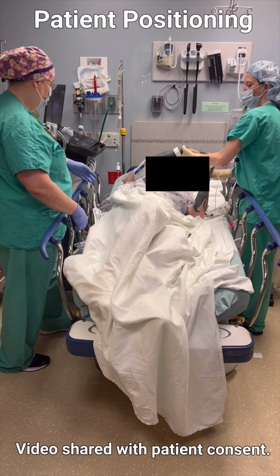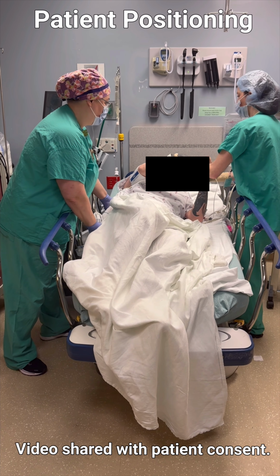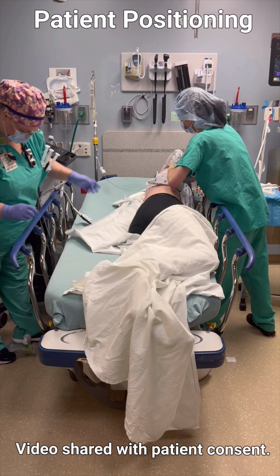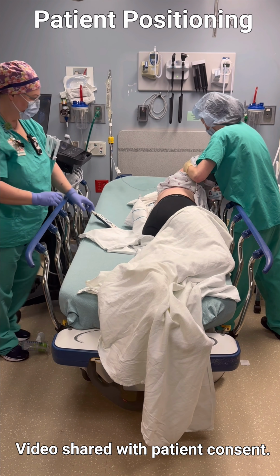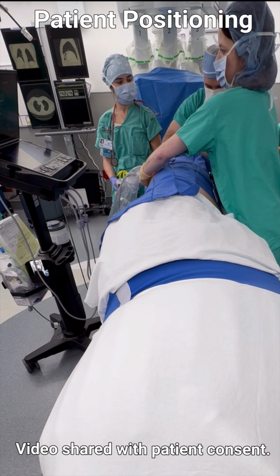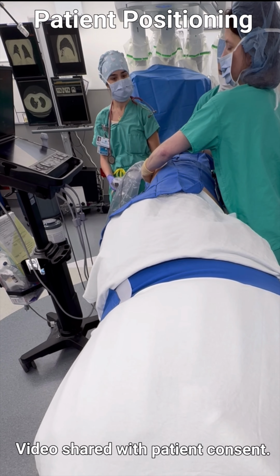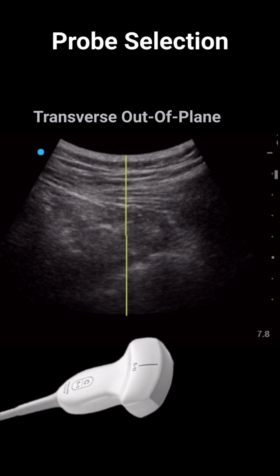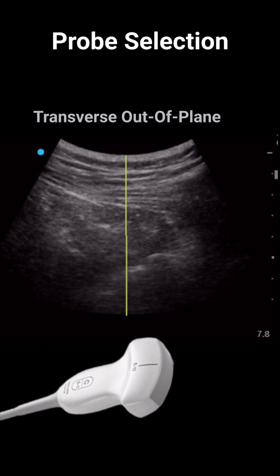Patients with rib fractures are often unable to move completely prone, and in these cases, rolling the patient as far lateral as possible with the fractured side up is usually sufficient. In patients already in the lateral decubitus position for surgery, the OR table can be tilted towards the operative side to simulate prone positioning.